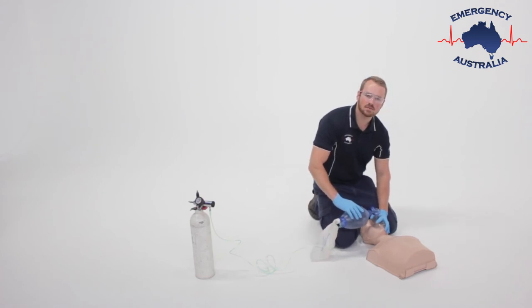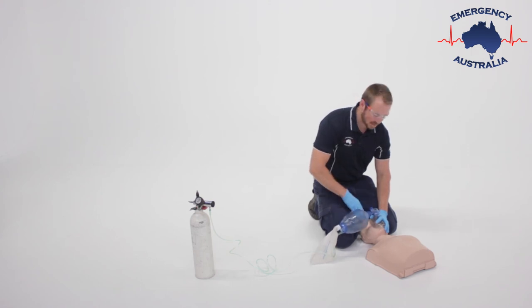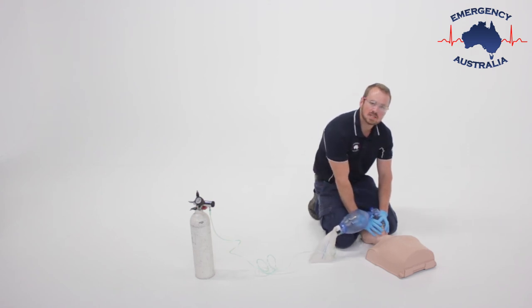With patients who have excess facial hair or are quite large, we may need another responder to help maintain an effective face mask seal.